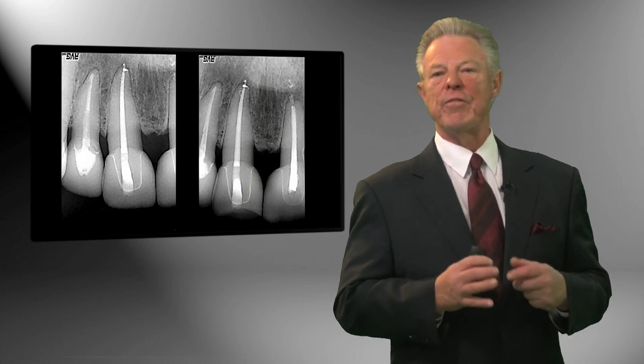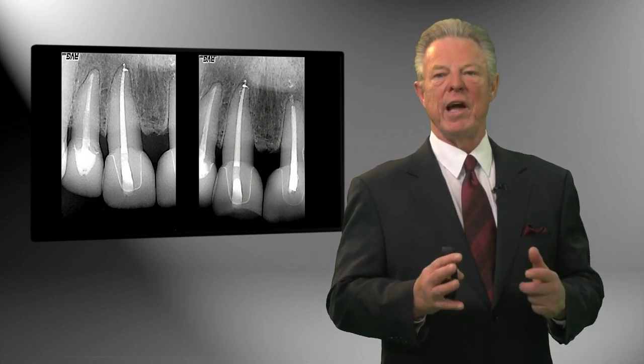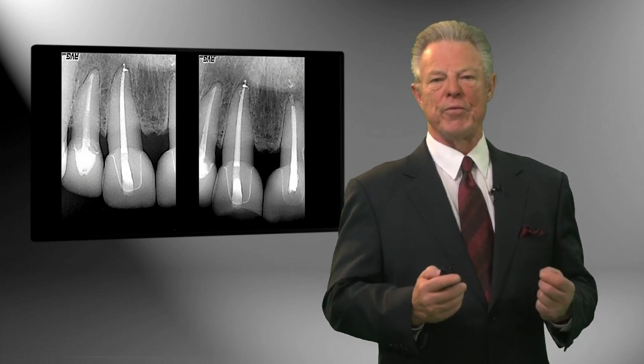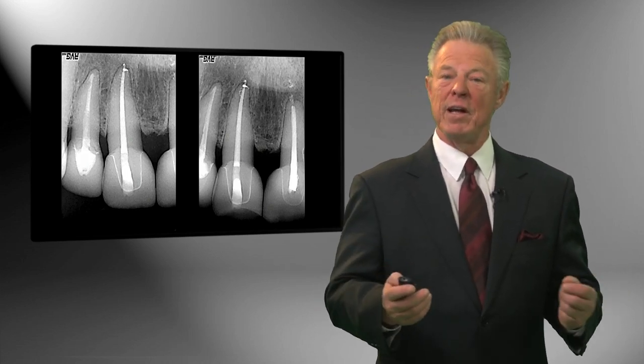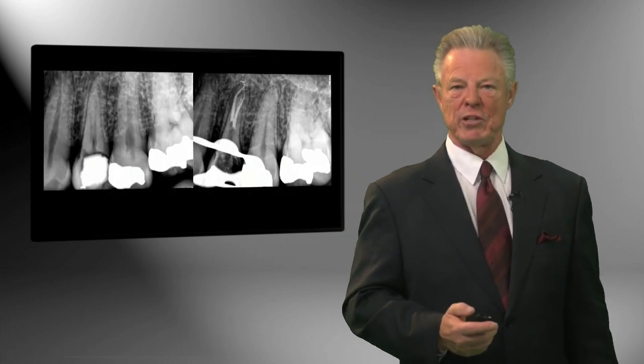You can see this is a very appropriate shape, and yet there was enough shaping for hydraulics, and we have protected the ferrule, and there's no mistake about that. This is a beautiful, beautiful shape. If I were to do this one over, and as I usually look at patients and say, if I were to do it differently without beating myself up, what would I do next time? And this one I wouldn't change much.